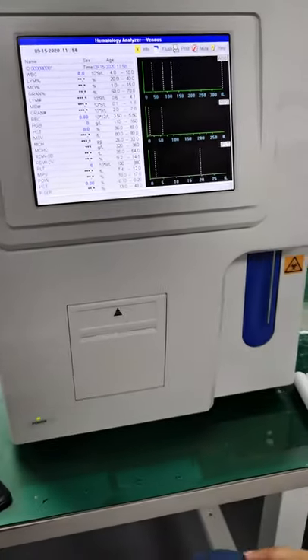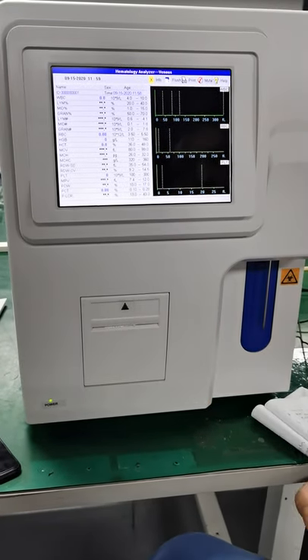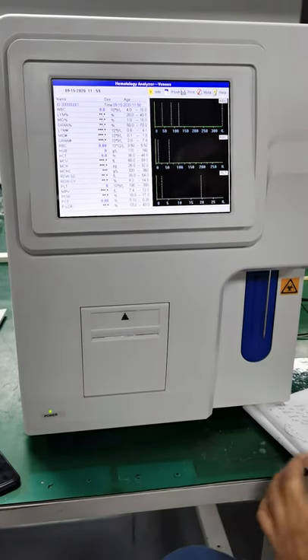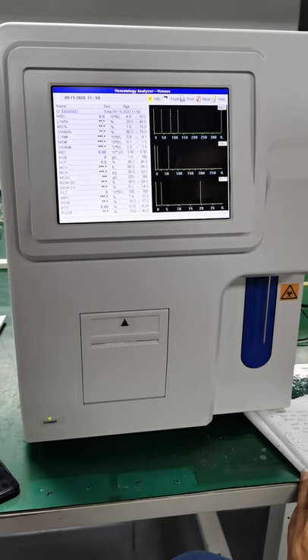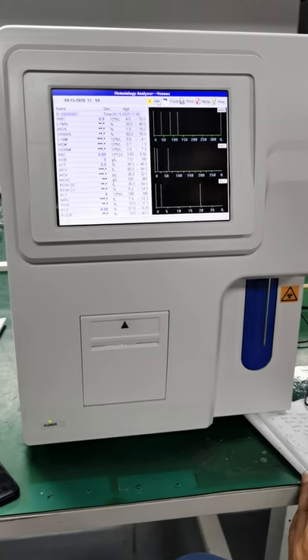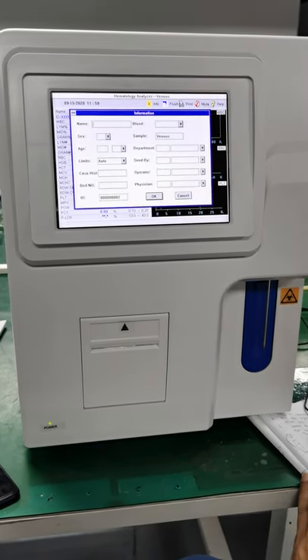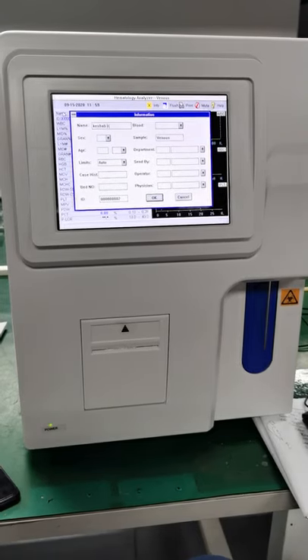Now we're going to go to the next step. I'm going to show you how we can input the information about a patient, okay? So you can see this screen, right? You can just click info, that means information, and then the name of the patient. If the patient's name is Keshav, okay?